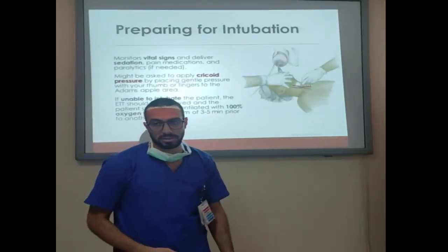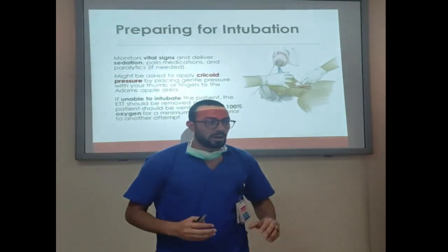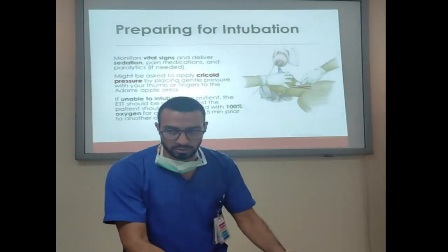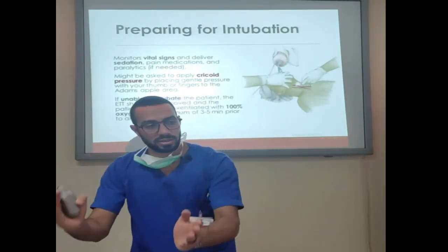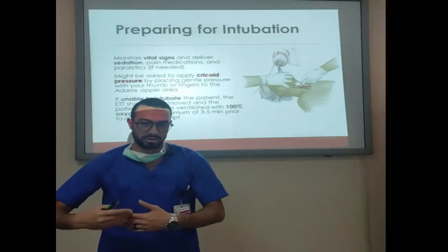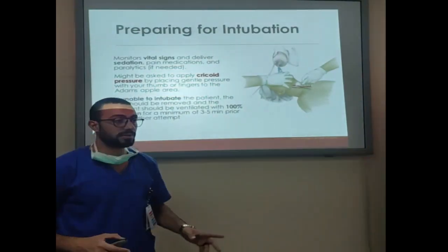This is all about the weaning. Nursing consideration. This is the last point today, and this is our care. I will talk first about our role during insertion of the endotracheal tube, and then after the endotracheal tube and in the maintenance phase. You should take care of the patient. How can you prevent infection and prevent complications during the ventilation?